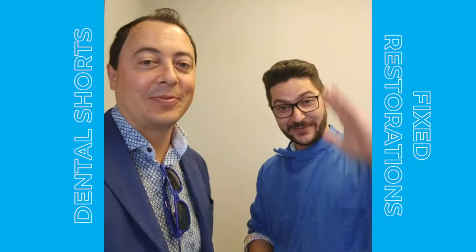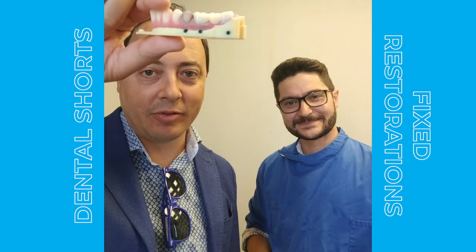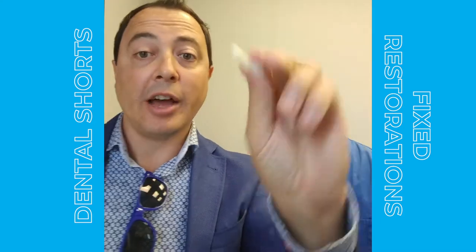Hello everybody, I'm Scott and I'm Kali. We're here with Proto 3000. We wanted to talk to you very quickly about fixed restorations. I have here a full-color polyjet printed model and affixed to it we have a temporary bridge milled out of PMMA.